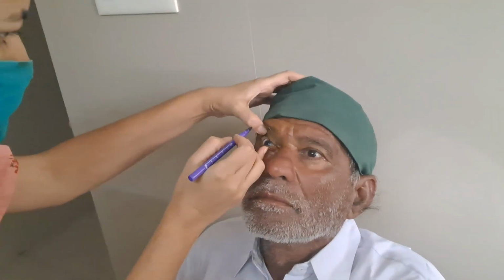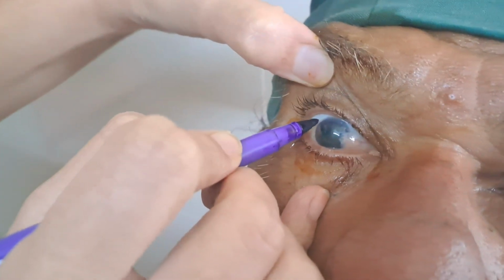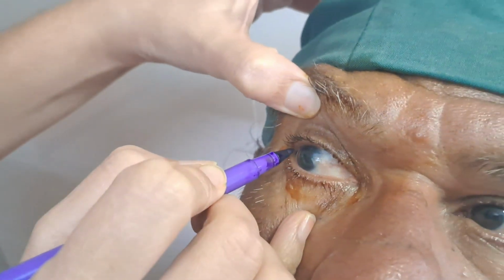Now we'll see how to mark the patient. After topical anesthesia has been instilled, you can randomly mark anywhere near the limbus on the conjunctival side. Try to get the mark within the interpalpebral fissure. Marking on a relatively dry eye allows for a more sustainable mark.